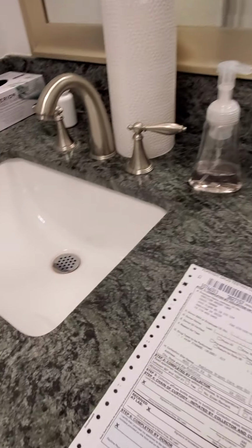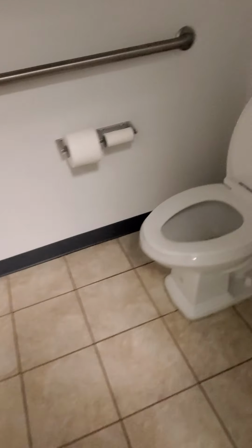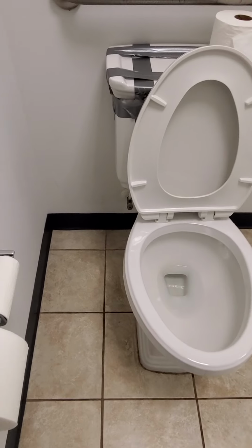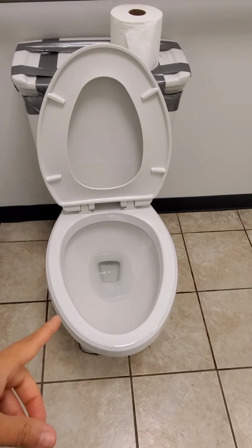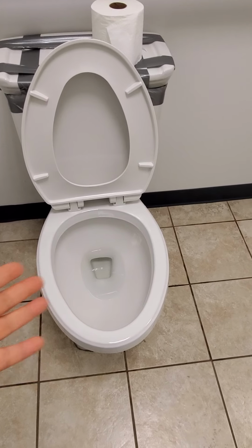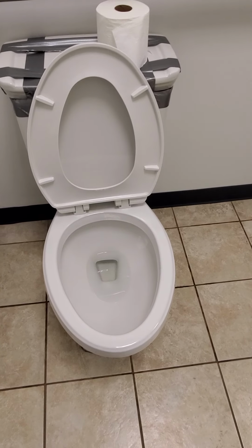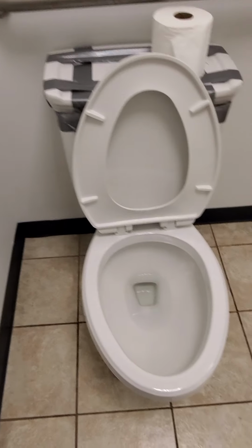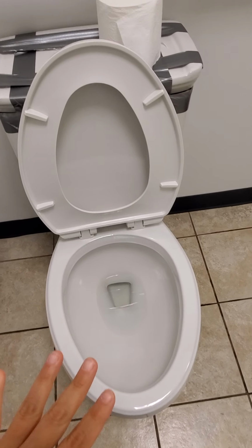While they're washing their hands, you can go ahead and pour some of this in the toilet. The reason why is because they will try to cheat and pass the test. They'll do anything and everything to pass it. They might grab some water from the toilet and say that that's their urine. So that's the reason why we need to pour some of this in there. Make sure that it is blue, completely blue. The water has to be completely blue.